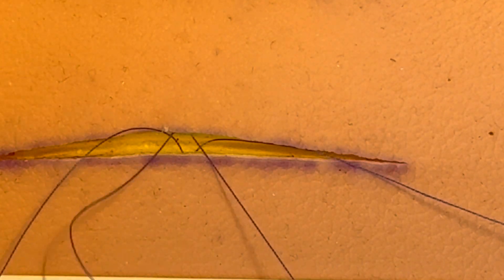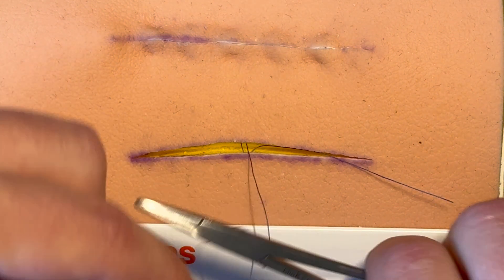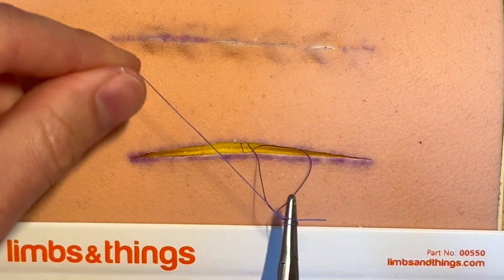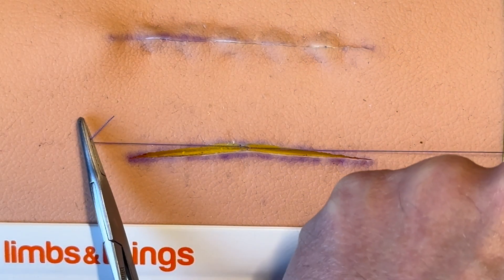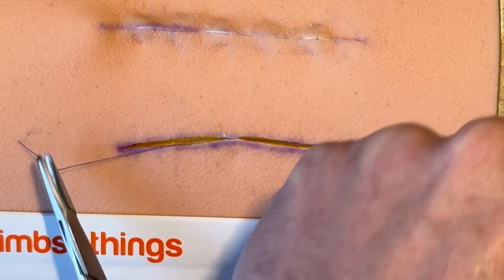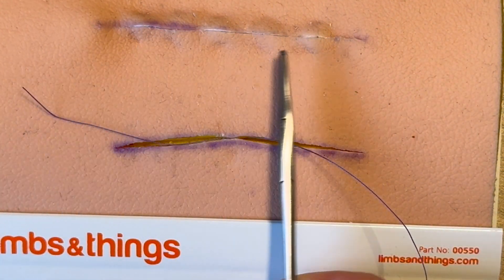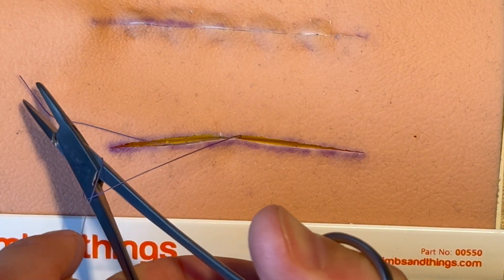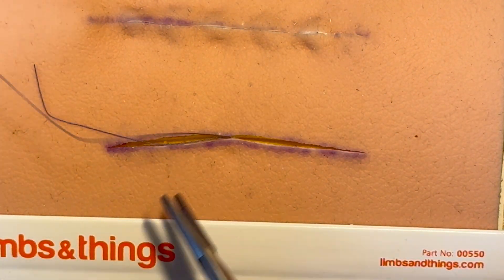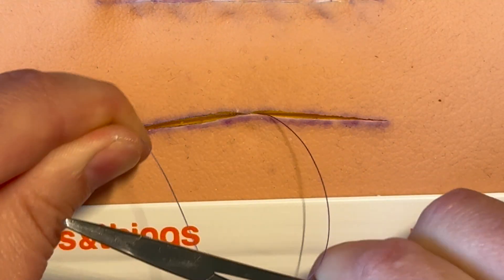This is a skin substitute so it may not behave exactly as real skin. Pull it through and then tie a knot as normal — a surgeon's knot, two throws — you'll see your hands cross in this instance. Keep that needle driver in the U of the thread, grab it, and tighten it a bit first if it's gone a bit loose.